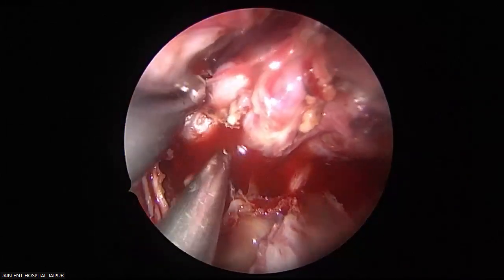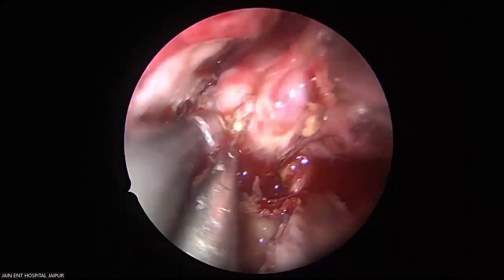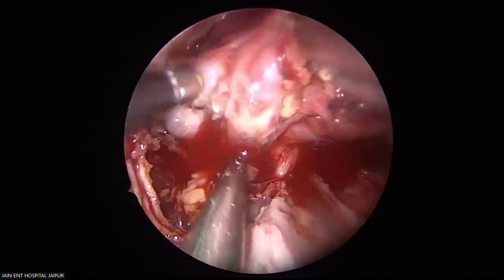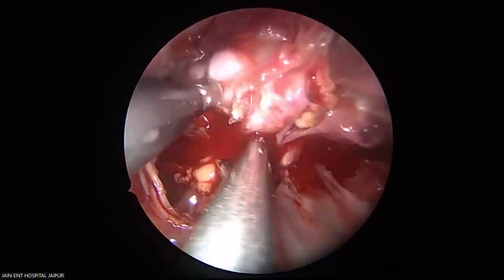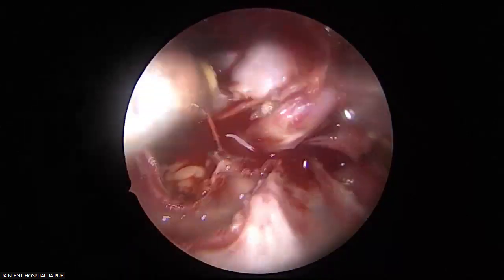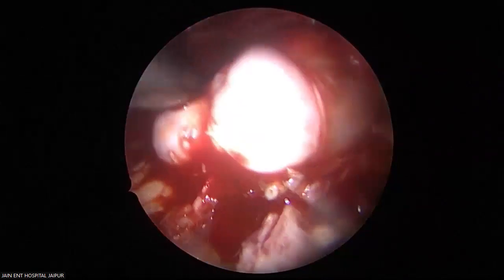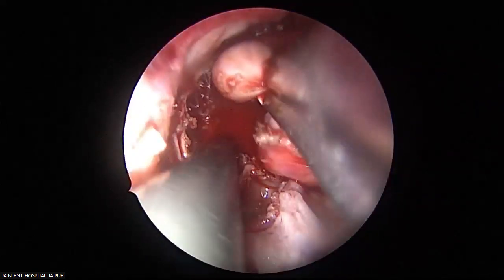See all the surface adhesions going into the tumor. You mobilize the adhesion, the tumor is coming inside. See now the last bit of the tumor.